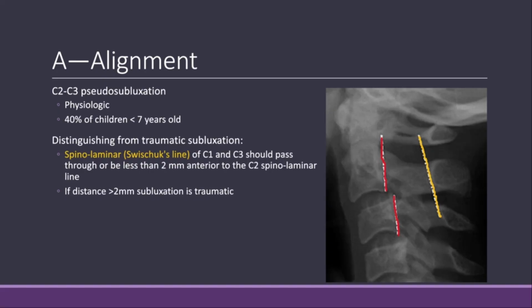Now, no one's going to expect you to get rulers out in the trauma bay, but if you look and see that some of the lines aren't as aligned as you would like, just make a note to review it once you're outside of the trauma bay and keep that cervical collar on.